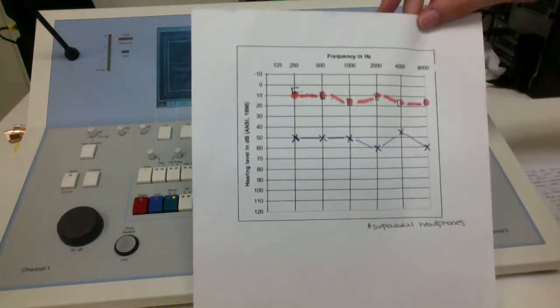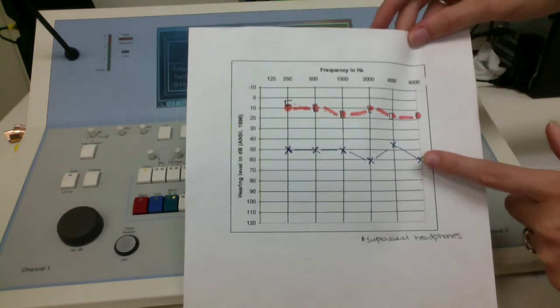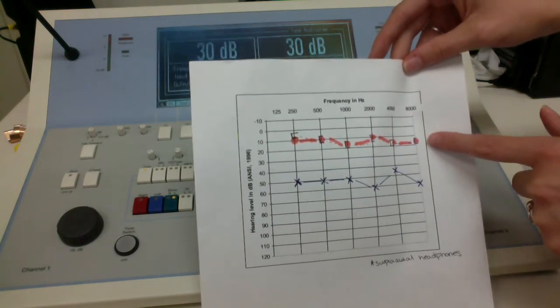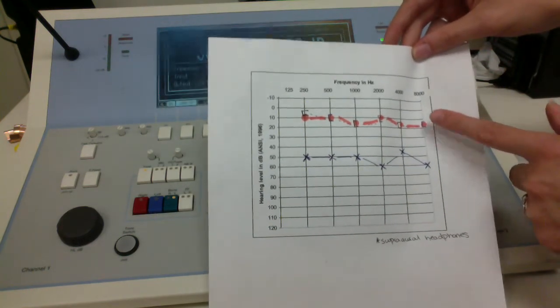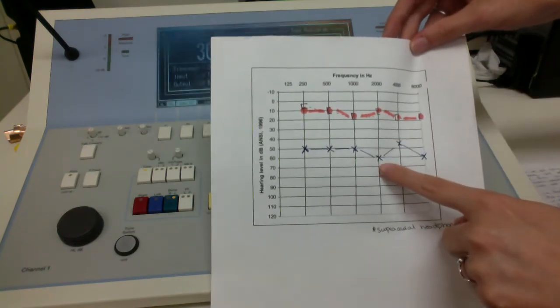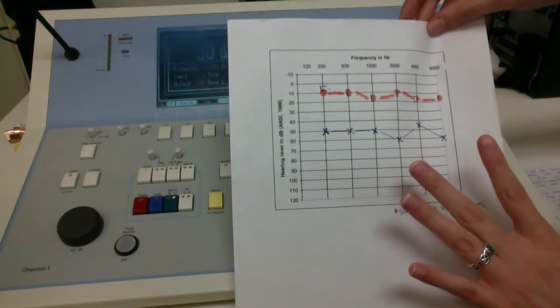All right, so there's just one rule for bone conduction masking, and that is that if the air conduction threshold of your test ear, our worst ear, in this case our left ear, if the difference between it and the bone conduction threshold for your non-test ear, in this case the better ear, the right ear, is 10 dB or more, you need to do some masking. So we're going to start at 2000 hertz, like what we talked about in the air conduction masking video, sorry.